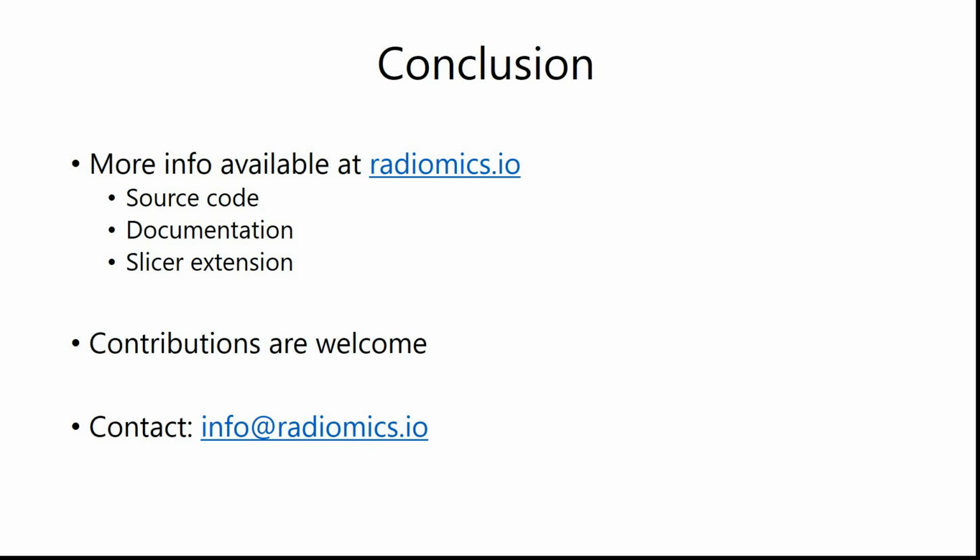This concludes the video on the development and usage of PyRadiomics. For more information, please visit our website at radiomics.io. Here you can find links to the source code and documentation, as well as links to the radiomics extension for 3D Slicer, which enables the usage of this toolbox directly from the Slicer environment.